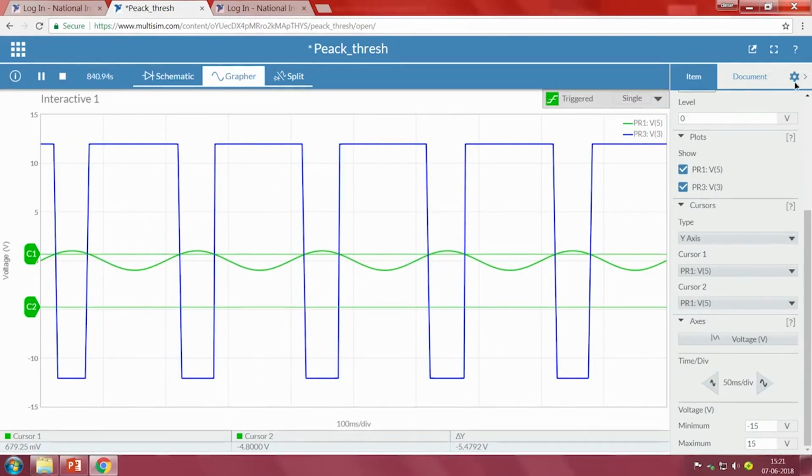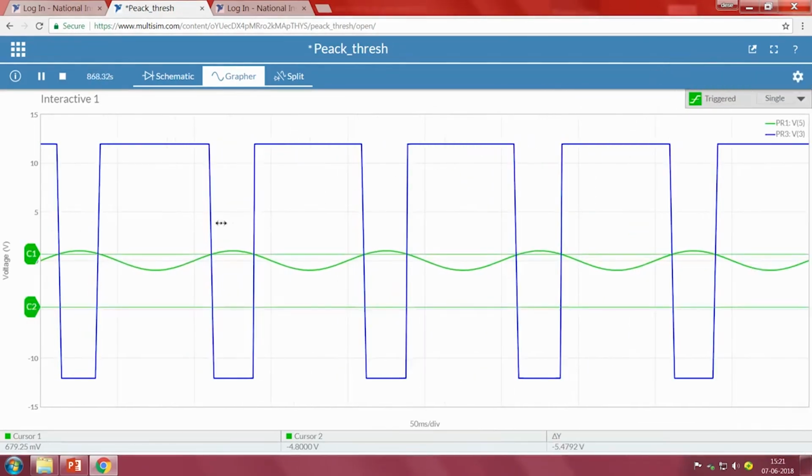Now, what to understand? One thing is clear, that C1 represents our threshold and the green color represents our input signal. What about the blue color? Blue is nothing but our output. Now, what is happening? Whenever the input signal is greater than the threshold value, it is going to minus VCC, right, and whenever the input signal is lower than that, it is going to plus VCC.